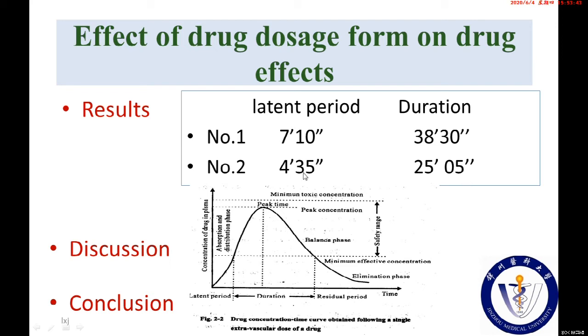Please compare. Mouse number 2 is administered the drug in solution. So actually here they have different latent periods and different drug action durations.